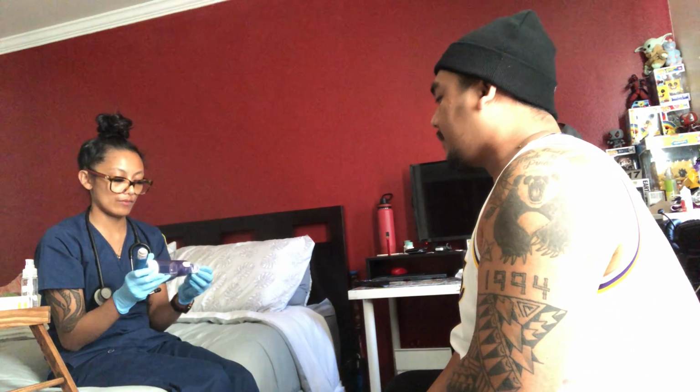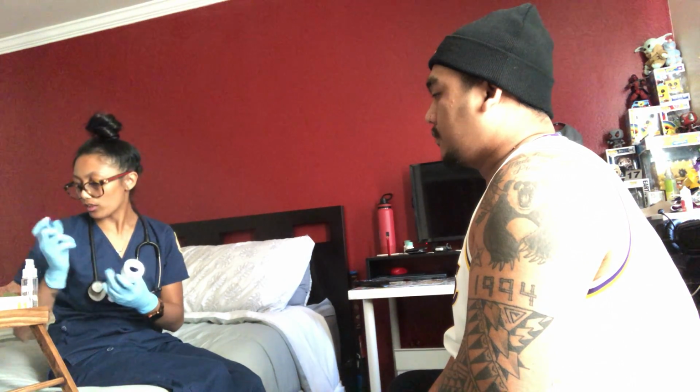Awesome, you did perfectly fine. Since you are going to be taking 2 puffs for 1 dose, you want to take the puff, wait a minute, and then take your next puff. Okay? Always want to store this in a cool place, never too hot. Okay, so you did awesome with this one.